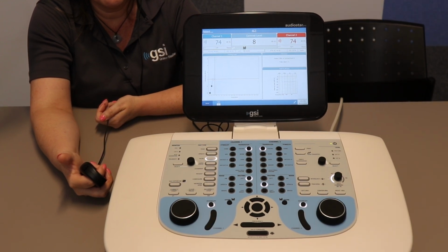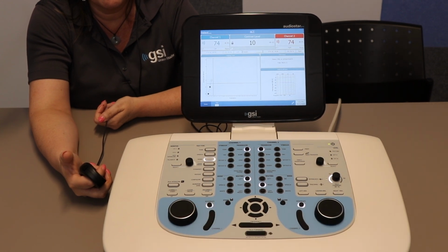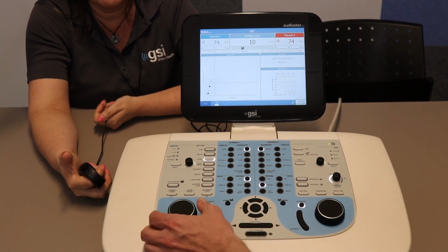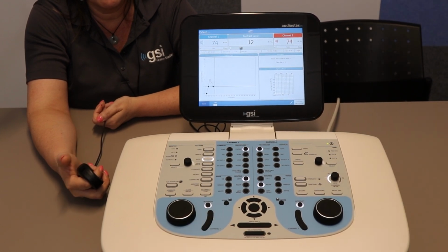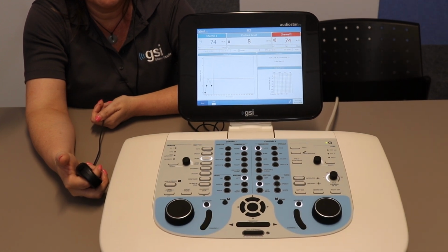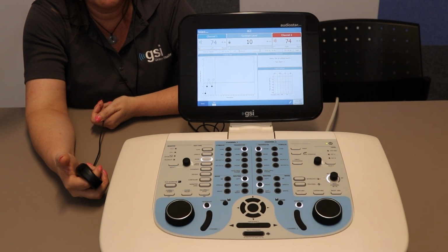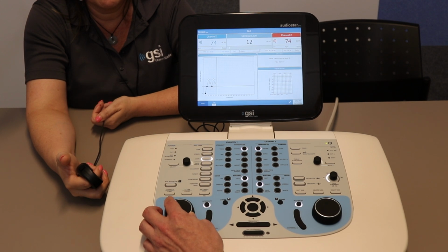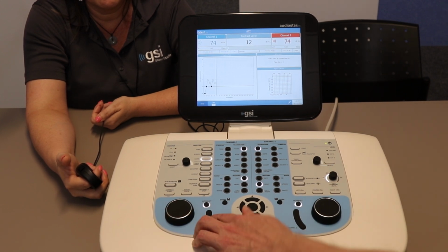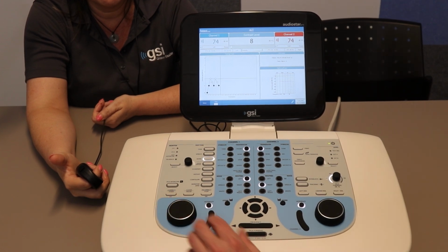And here we have no response, so my job is to bracket. I'm going to move it to 10, put the stimulus back in again, and no response. So I'm going to go back to 12, put the stimulus in, and we have a response. I'm going to continue my bracketing here. I'm going to put a contrast level in at 8, and you can see no response there. In addition, over on the left-hand side here, you can see what contrast level you're at, and also if the patient has been giving you any false alarms. So now I'm going to 12 again, and another response.